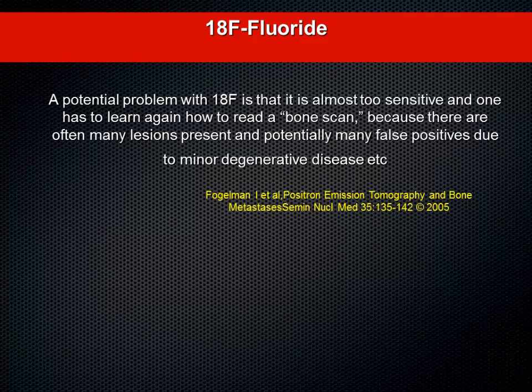And it's a famous statement by Professor Fogelman. I clarified this even last week. I asked the same question because every meeting I go to, they ask me the same question: what is the role of the MDP bone scan in the era of PET scanning, and will the fluoride scan replace the MDP bone scan? And he says the potential problem is it's almost too sensitive, and one has to learn how to read a bone scan from the start again, because there are often many lesions present and potentially false positives due to minor degenerative changes. So you need a gap, you need a learning curve.